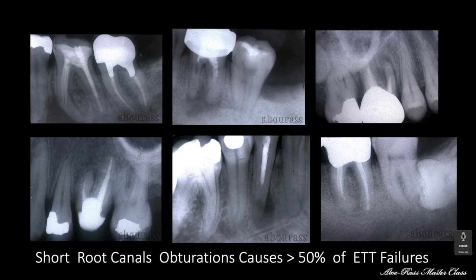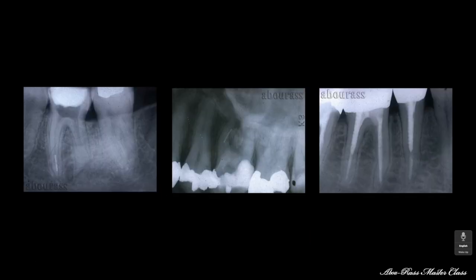And this dead space creates the AP. It's responsible for 50% of our endodontic failures. And that is a very large percentage. So when you look at the errors, broken instruments, and perforations, they are all in the range of one, two, three, four. But short fillings are the cause of substandard endodontic treatment failures. And they make us require surgical intervention.